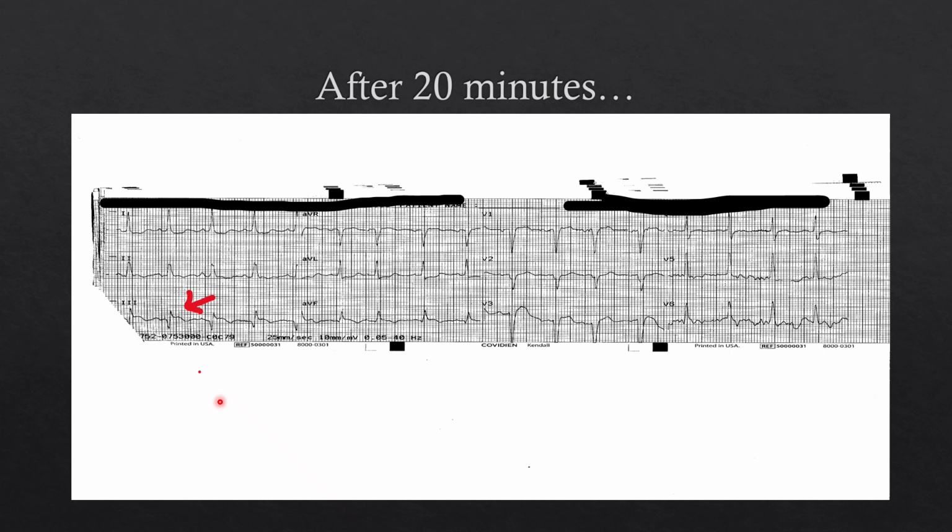They had really minimal symptoms other than some mild chest discomfort, some dizziness and nausea. And this absolutely helped triage patients to the right place and get them that care so they could have a good outcome. So that's where serial ECGs can help.